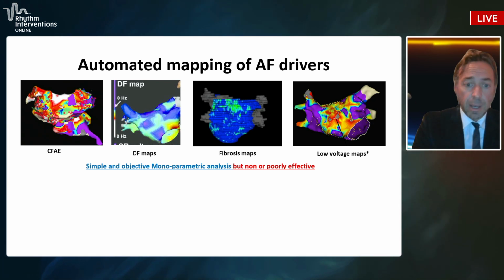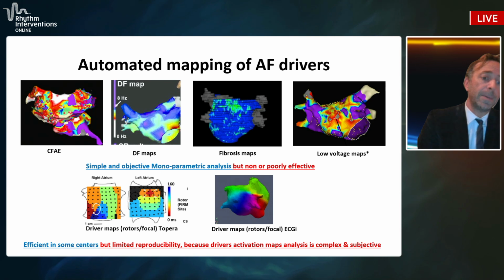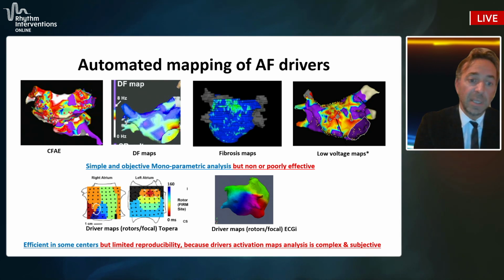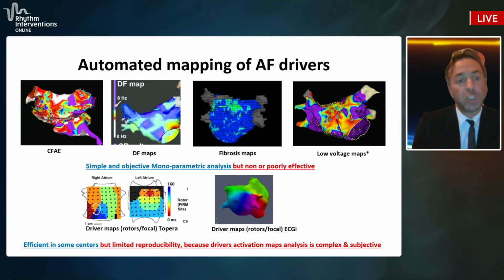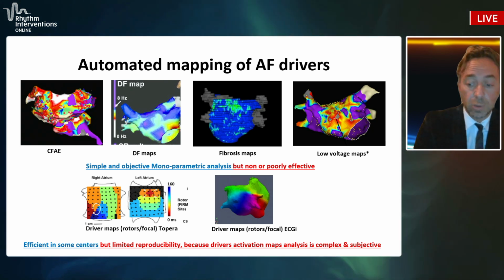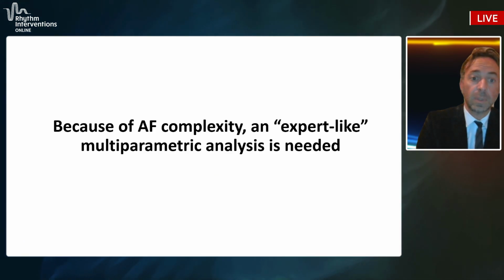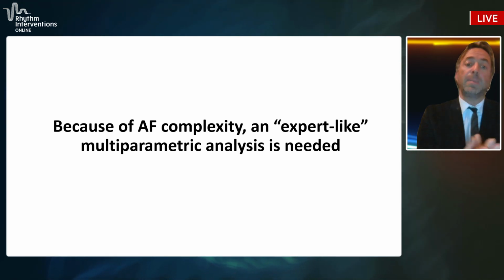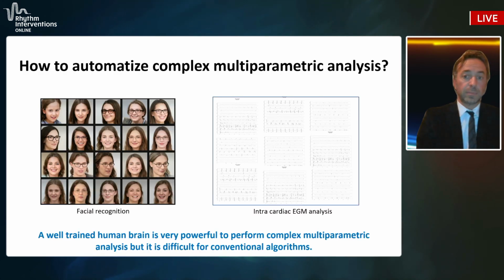We can discuss later. We also have different tools available that perform driver mapping using different technologies like Topera or ECGI. These technologies can be efficient in some single-center experiences, but here too the reproducibility is limited, because driver activation map analysis is also complex and subjective. So because of AF complexity, an expert-like multi-parametric analysis is needed.